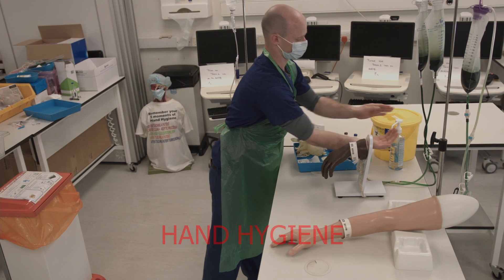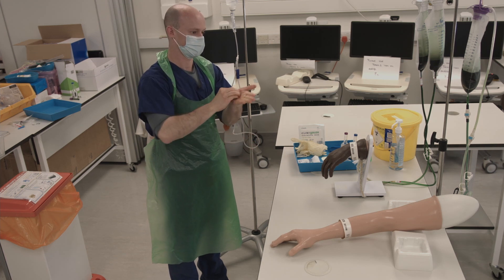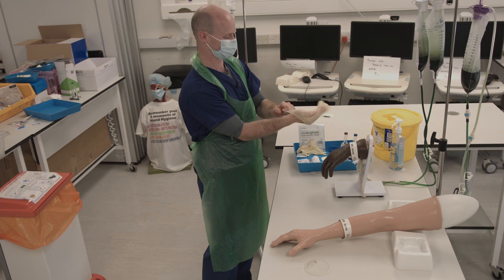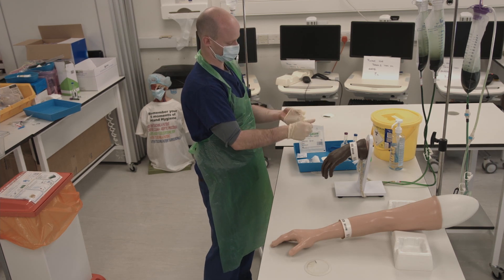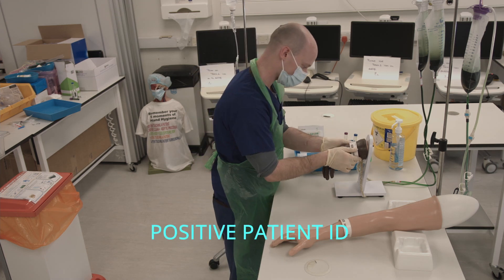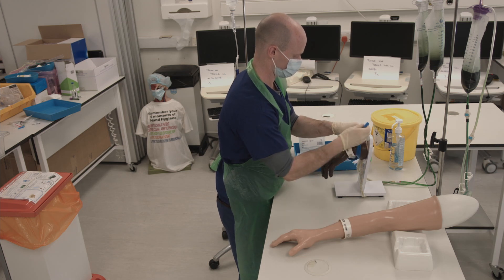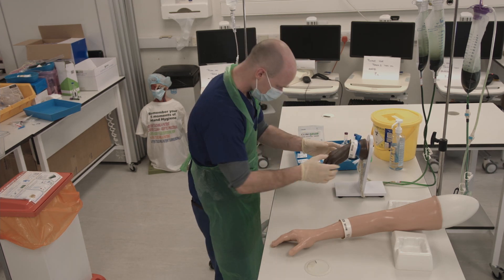Enter the patient area and wash your hands thoroughly as before. Put on your non-sterile gloves and identify the patient by their wristband. You can now place the tourniquet and palpate for a vein.